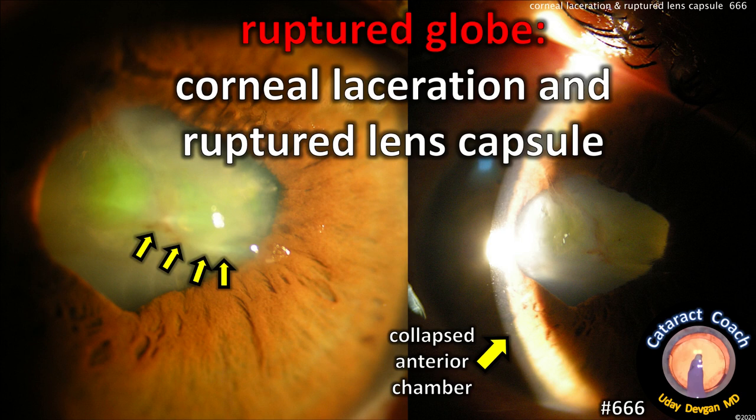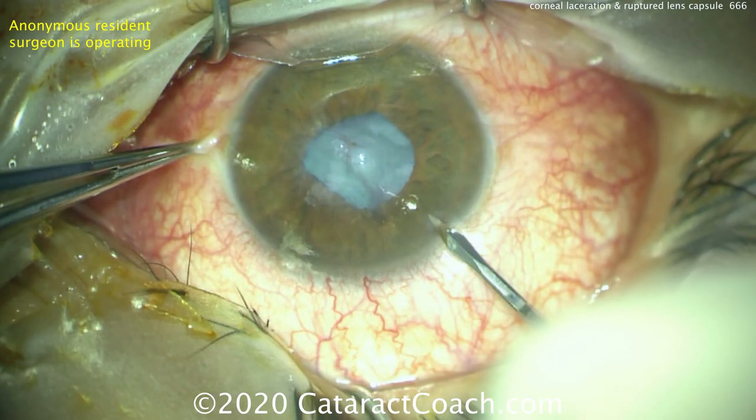CataractCoach.com. We've got a ruptured globe, corneal laceration, and a ruptured lens capsule. You can see the collapsed anterior chamber. This patient needs our help.